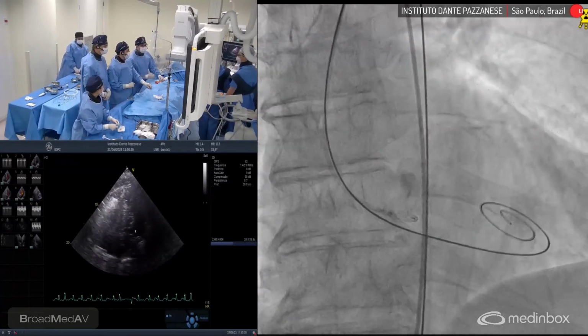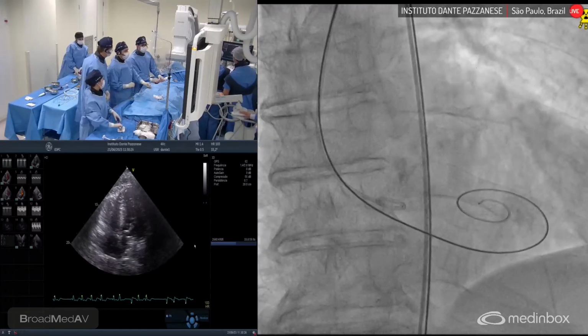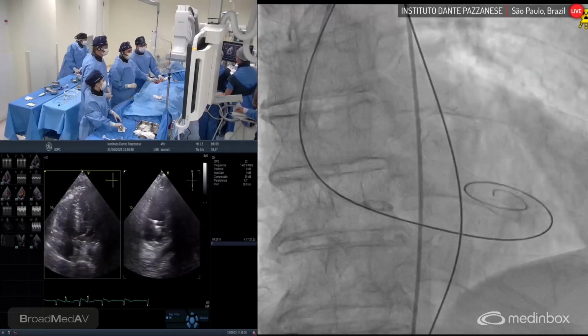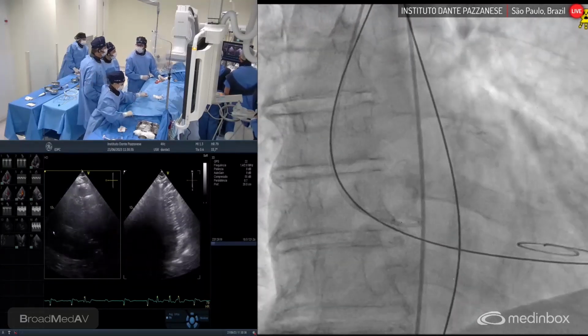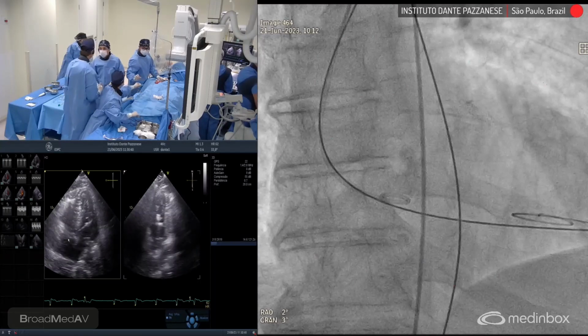Dimitri, are you satisfied with this position? It doesn't interfere with the mitral, right? Could you check, please? In that position, it's kind of hard to say. That's a very important point that Dimitri mentioned. In that position, it's hard to say because of all the subvalvular structures. Sometimes you can get a mitral regurgitation because of the wire.